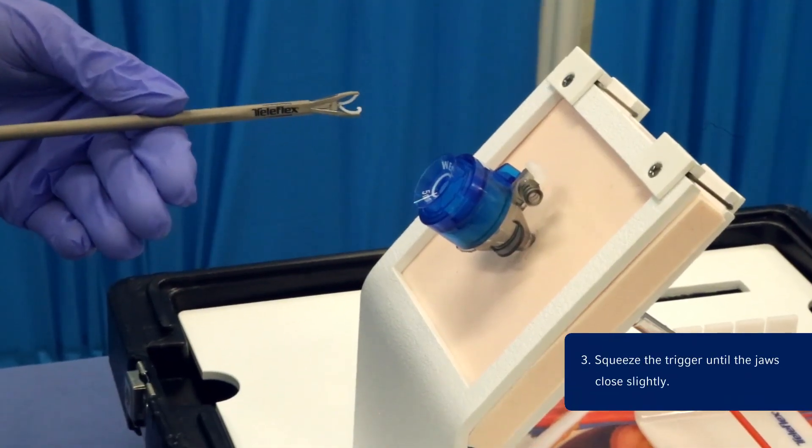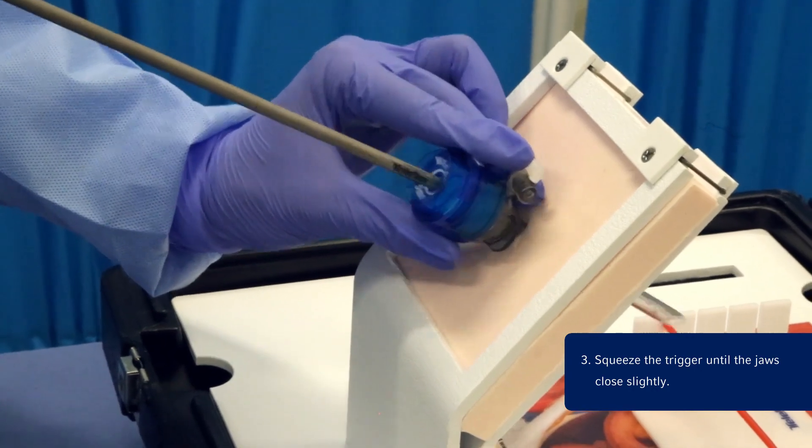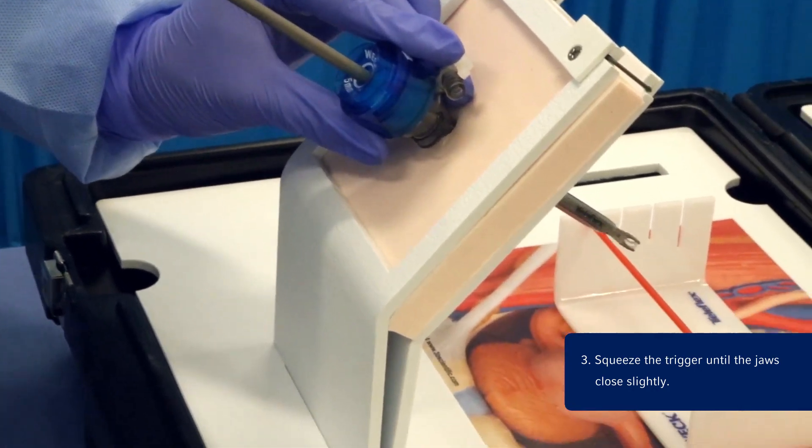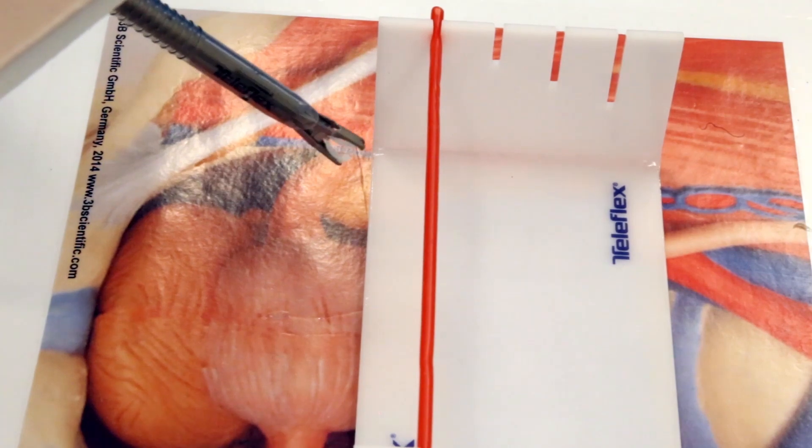Step 3: Squeeze the trigger until the jaws close slightly, not enough to completely close the clip, and insert the jaws and shaft down the cannula. Once the jaws are visible past the distal tip of the cannula, release the trigger to return the clip to full aperture. The applier jaws are designed with three points of contact to provide additional clip stability, preventing unwanted clip movement when ligating.